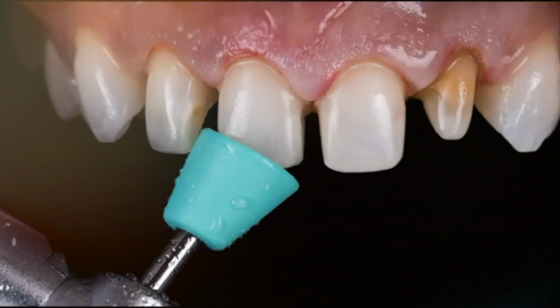Is factored by the stain, by what you paint on the surface of the ceramics, and at the end also with the dark inside of the mouth. So all of these things come with the color at the end.